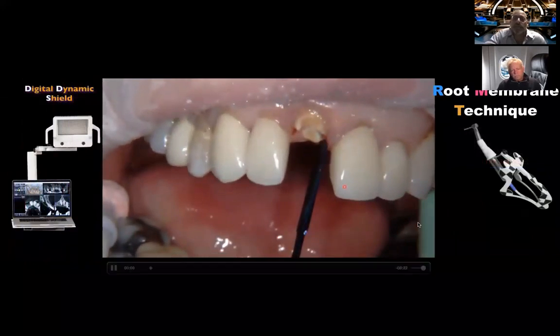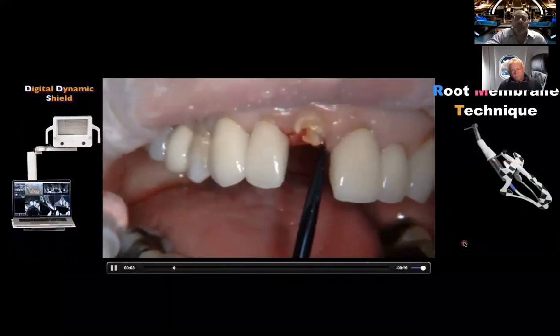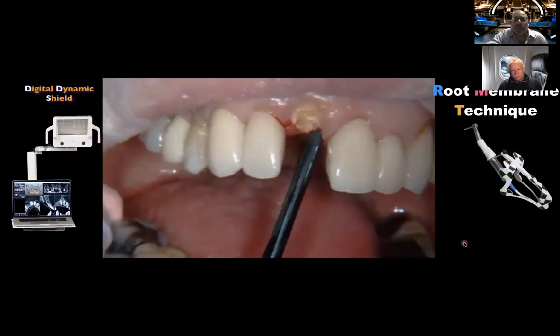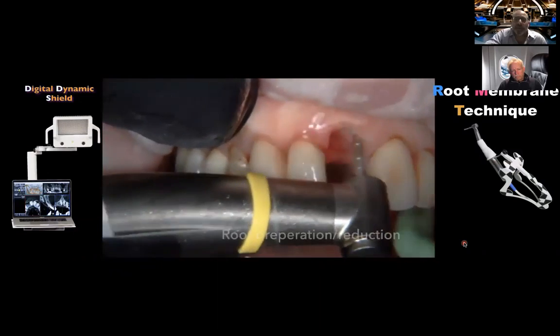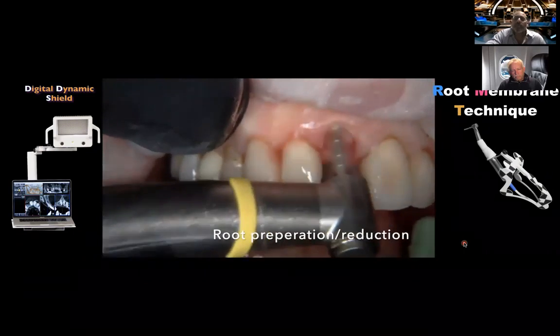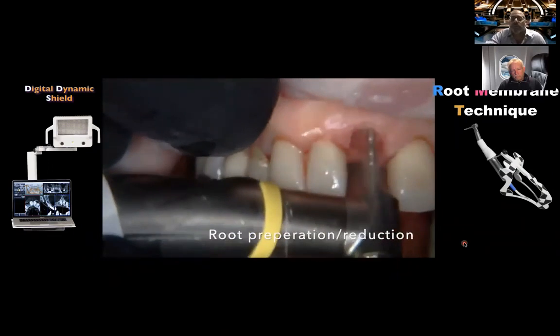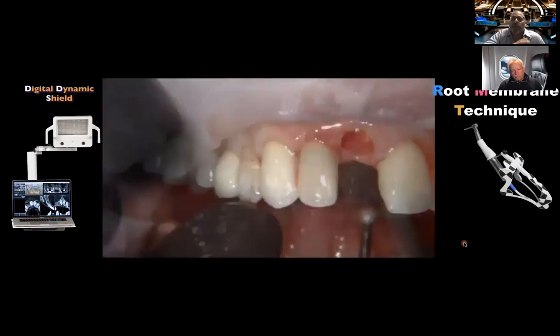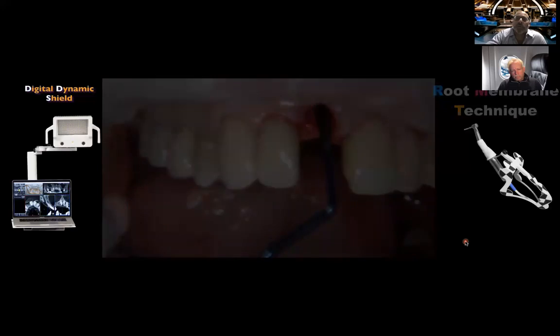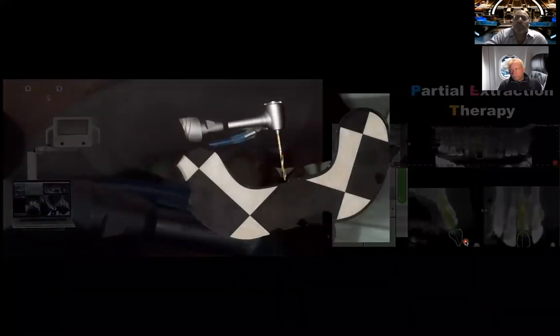We then can extract our tooth. Now I'm using a periotome here, and an elevatome from my company, TBS Dental. So I am biased. I believe these are the best instruments. There's my Scott Ganz forceps to remove the remaining root tip. And then we're prepping, again, we can do this in real time or freehanded, just prepping the internal aspect of that root, debriding out that site, and we're going to start to look into implant placement.